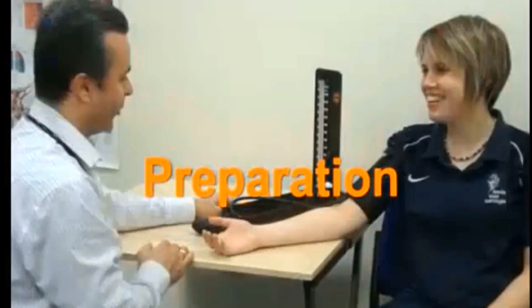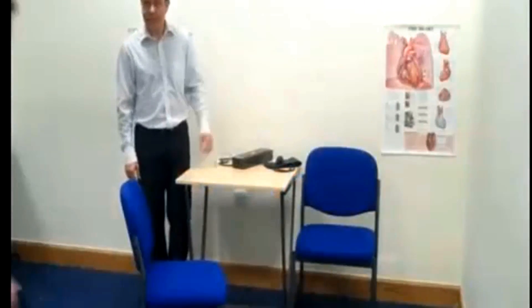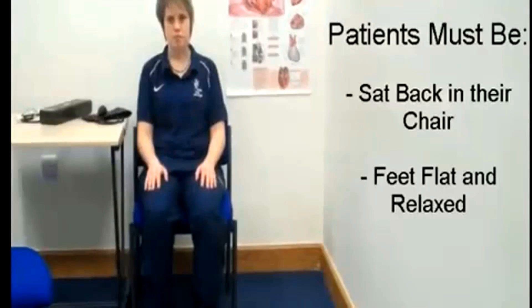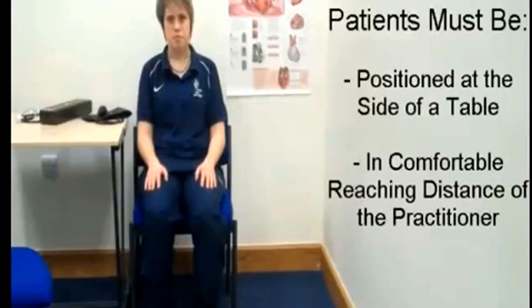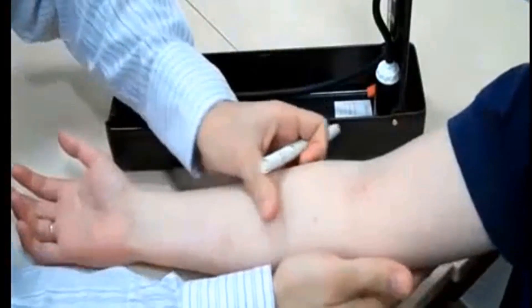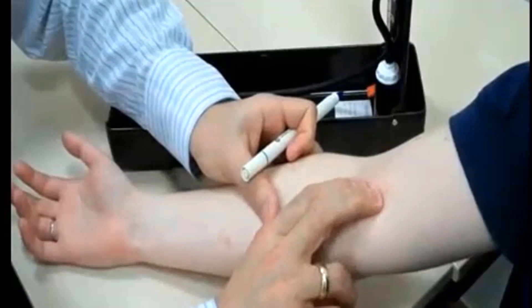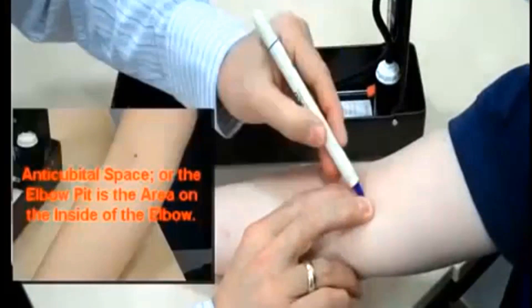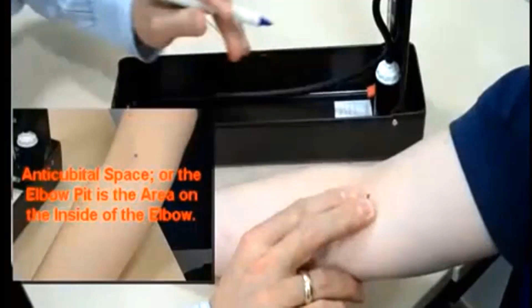Step two: prepare the patient. Make sure the patient is relaxed by allowing five minutes to relax before the first reading. The patient should sit upright with their upper arm positioned so it is level with their heart and feet flat on the floor. Remove excess clothing that might interfere with the blood pressure cuff or constrict blood flow in the arm. Be sure you and the patient refrain from talking during the reading.